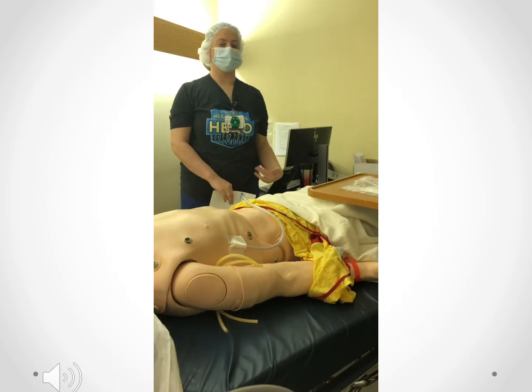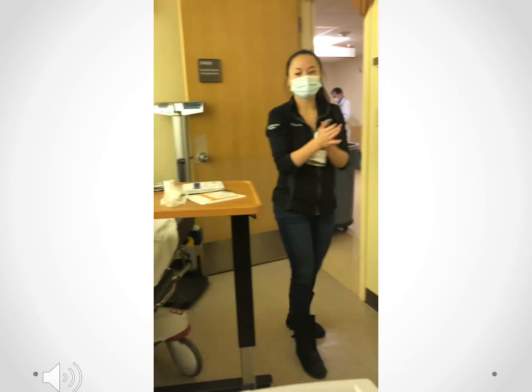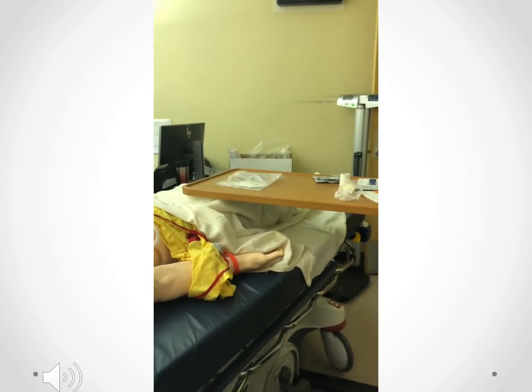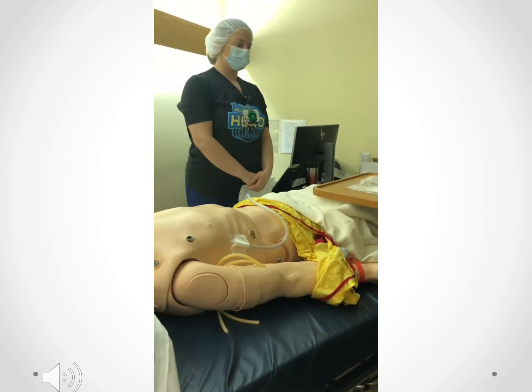This is Katie, I'm Liz, and we're going to show you how to do a chest tube dressing change. Katie will be sanitizing her hands, proper hand hygiene. She has all her supplies ready here.